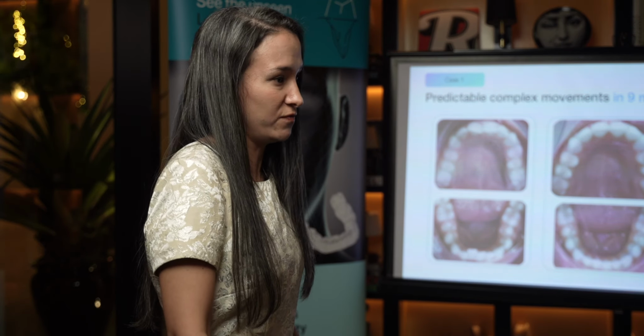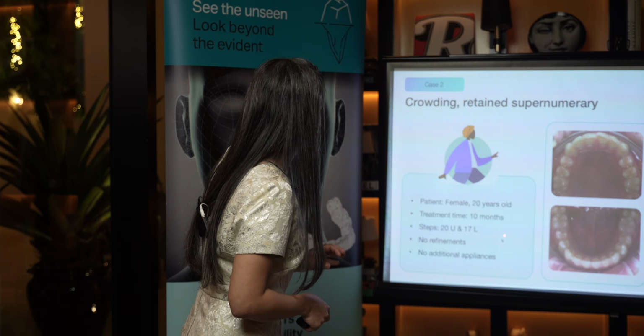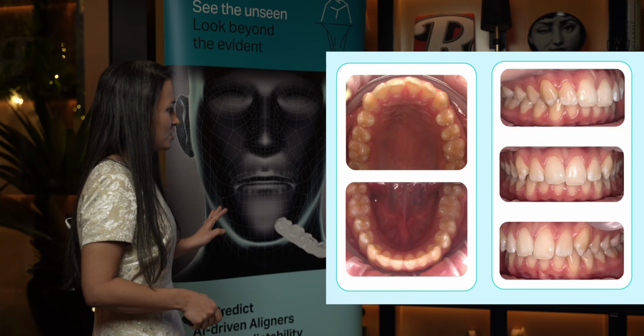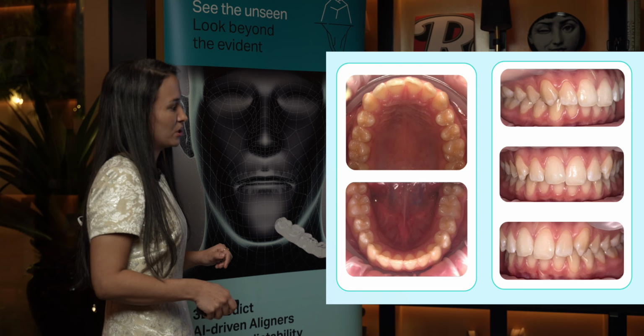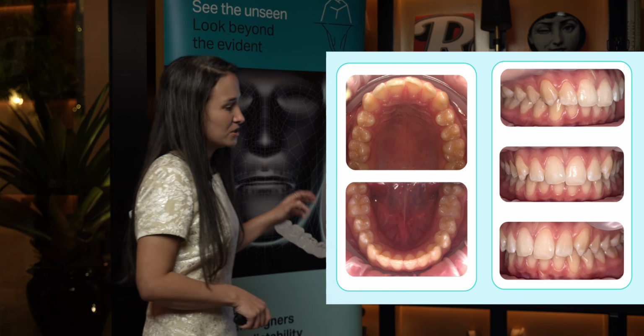She never had ortho before. So this is a case that we did use CBCT, and it's a very interesting case because it has a supernumerary upper canine. Normally, if I would see this type of case, just some crowding, nothing severe, obviously some intrusion that needs to happen on those centrals, I would say this case doesn't have a CBCT.